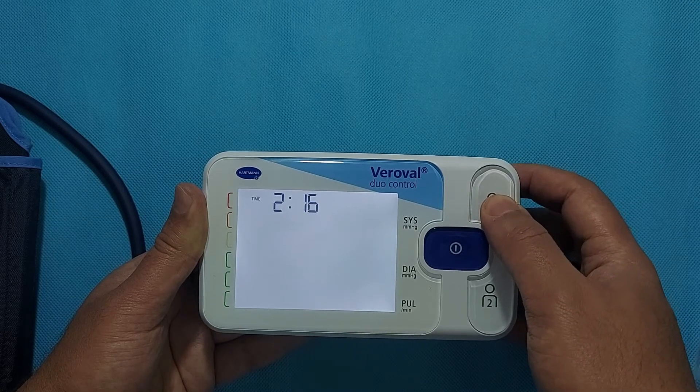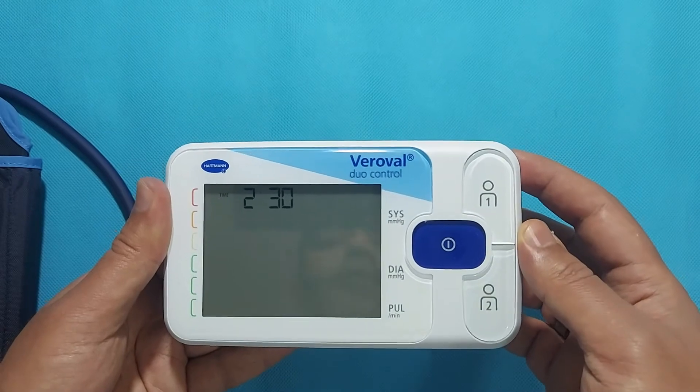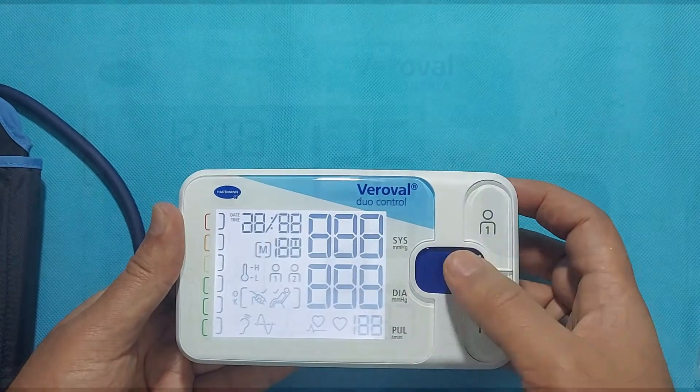The time settings will display after the date settings. Using the same techniques, first modify the hour and then the minutes.